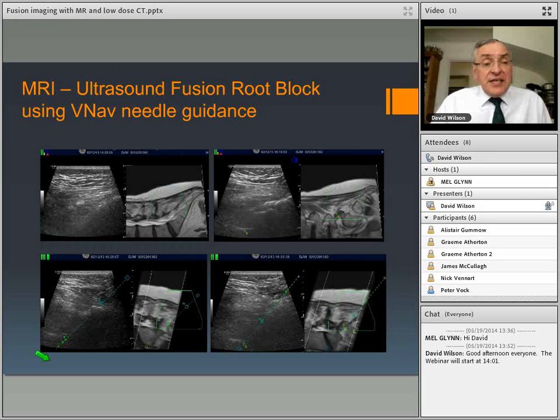We can see here that I've identified a point which is near to the nerve root, and I do the same with the SI joints. And we can see that the target point, little green marker, has been placed. If you look at the top right image, I'll show you with the little green pointer. Here's the target point. It's the same structure. It's next to the L5 nerve root. I was doing an SI joint and place it over the SI joint.